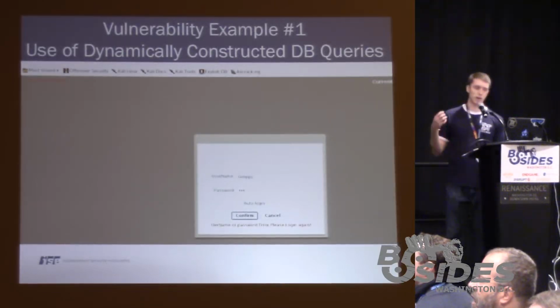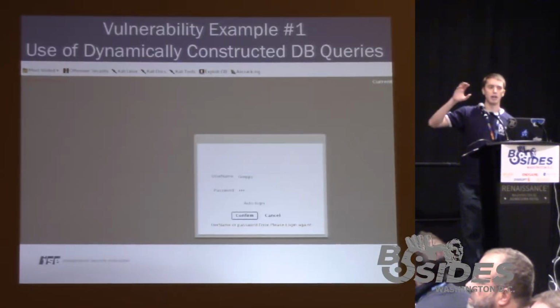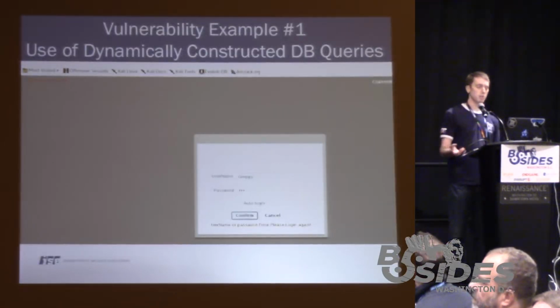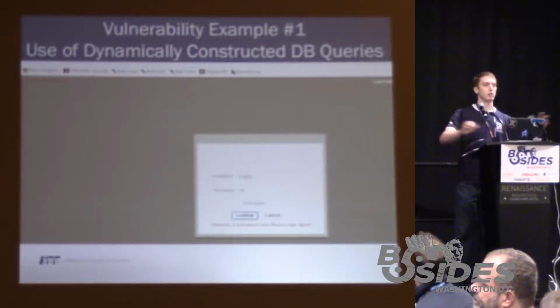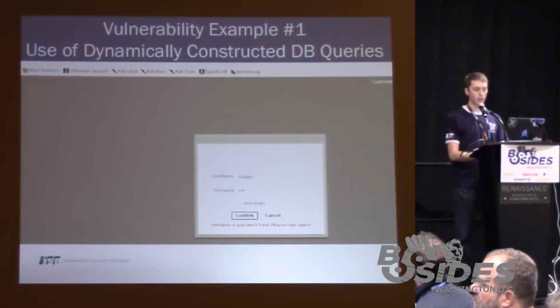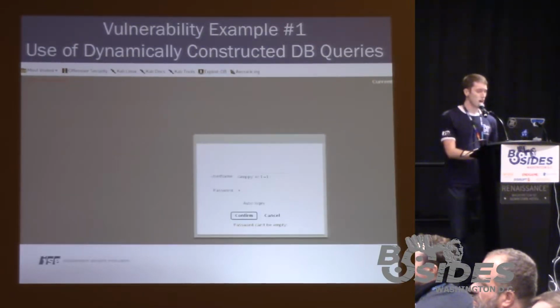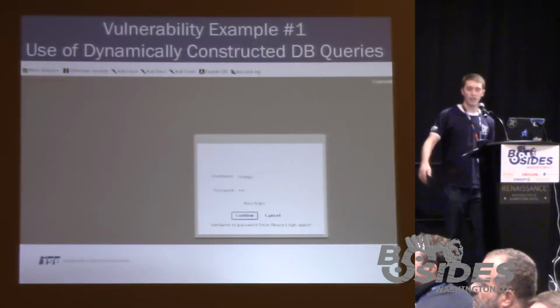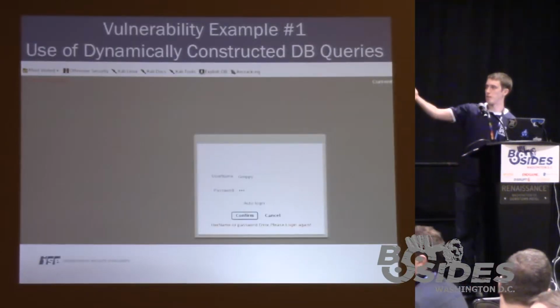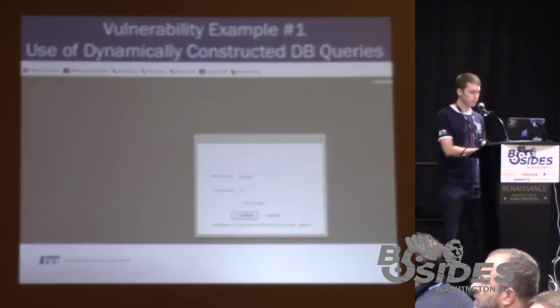As you can see on the slide here, we have a web portal, and we're presented with a login page. It's kind of hard for you to see, but this is the login page to a monitoring system for a hospital. This allows you to monitor all the patient monitors that you have deployed in a hospital or on a floor, or however your deployment may work. Basically, what I'm demonstrating here is that we're attempting to log into this portal with the username of Gimpy and some bunk password. There is some red text at the bottom that says the password is incorrect, so we're unable to log in.